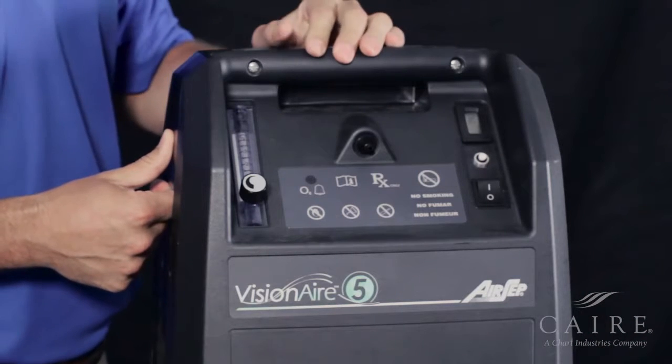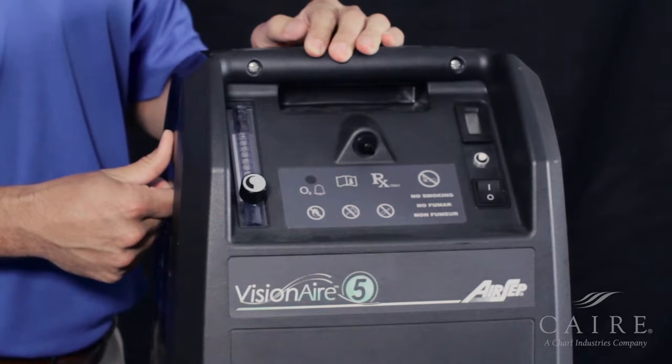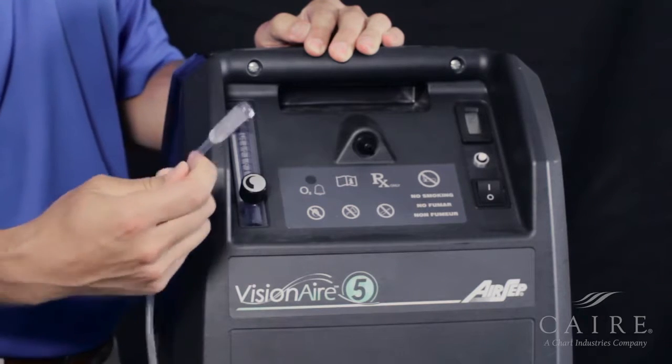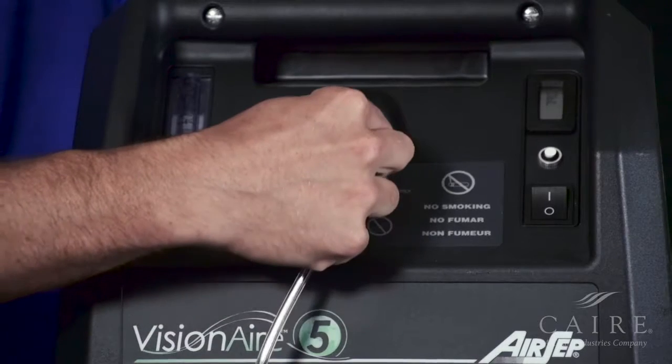Once this has been identified, go ahead and take your cannula or humidifier bottle and connect it. Since we already have our cannula right here, we're going to connect this first. Simply take your cannula, the female end, and connect to the barb, like so.